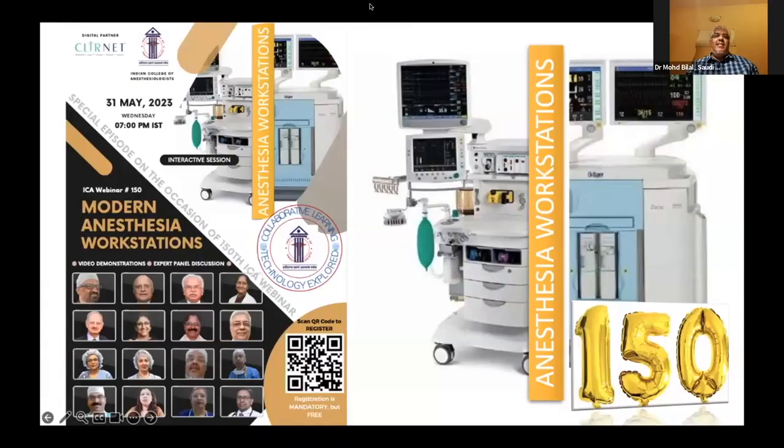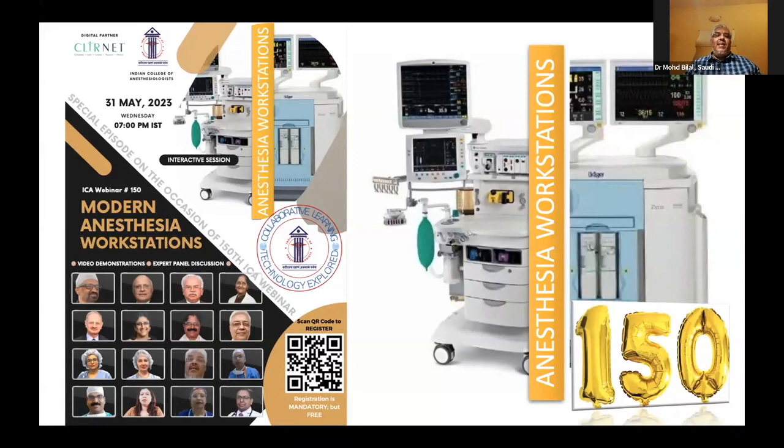be MRI compatible. So we have an area, and 2 or 3 of us are trained on the safety of MRI. So these guys keep inspecting, checking things. And patients with pacemakers, with old type of implants, clips which are old type. Now the latest are titanium, so they don't affect much, except for the quality of the image. Otherwise, everything was fine.